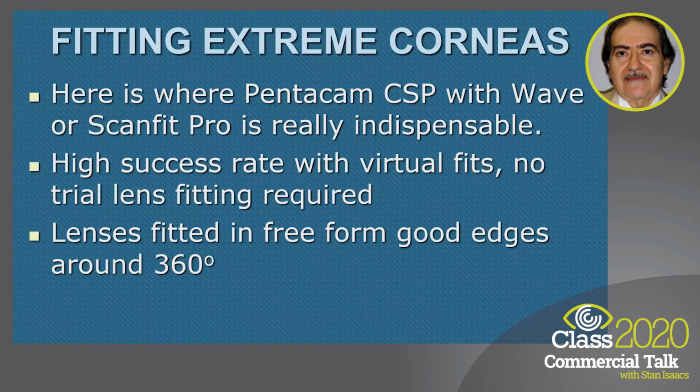work, and trial lens fittings are really a thing of the past. With COVID and all sorts of other things, the last thing you want to do is to put 5 different pairs of lenses in and out of a cornea in order to judge, oh, this is better, this might be worse, and let's order something in between. The other advantage of this is that with normal RGP fits and semi-scleral fits, you cannot really judge if the lens is tilting or if it is actually fitting in a 360-degree round circle around the cornea, sitting on the sclera and not tilting and not moving off position.